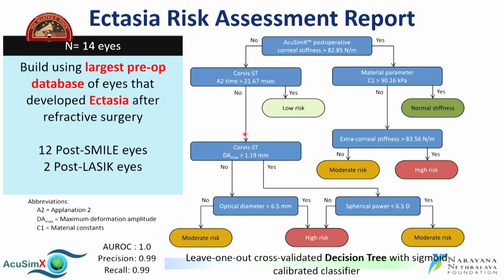And we have come up with a nice decision-making nomogram based on our results, and this is probably one of the largest data sets included in the software of patients who actually ended up with ectasia, that can assist you in deciding which surgery to perform.